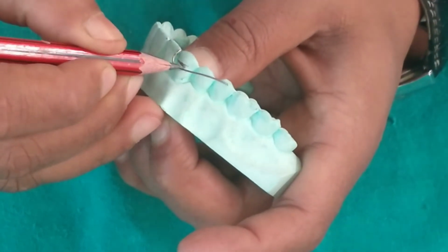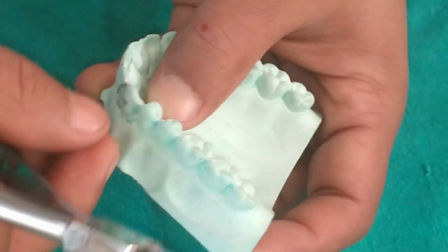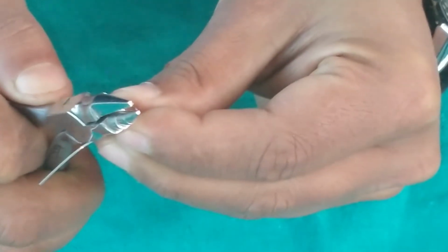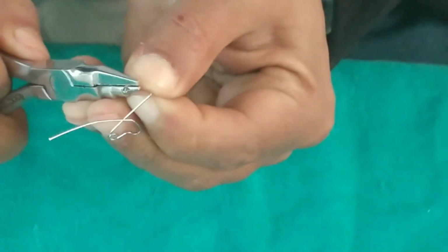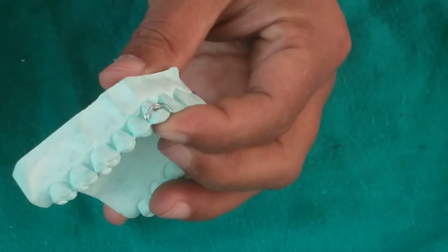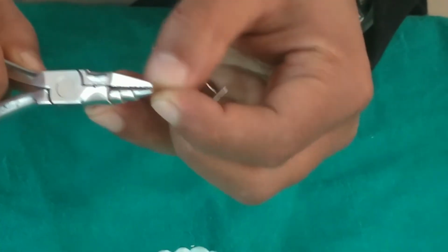The end of this retentive arm is given a small loop to blunt the ends. Now the wire is cut and a retentive tag is given at the ends to avoid the sharp ends from impinging onto the oral mucosa. The buccal arm is given a loop, and also a palatal retentive tag is given on the palatal arm, which engages the acrylic.